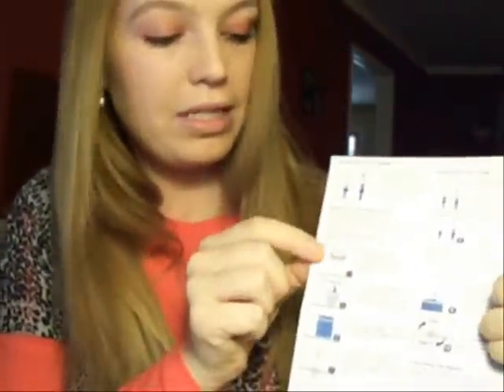I did read over this a little bit earlier, so it's fairly simple. Before you take this test, you do have to wait 3 days, so you cannot have any ejaculation for at least 3 days. For that obvious reason, my husband is not going to take this anytime soon because I'm getting ready to become fertile, coming into my fertile period, so we're going to wait until after I ovulate. But it's really simple. Basically, you take the semen sample.